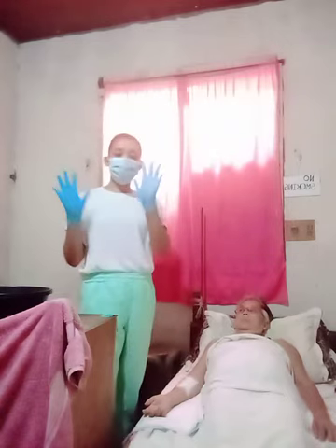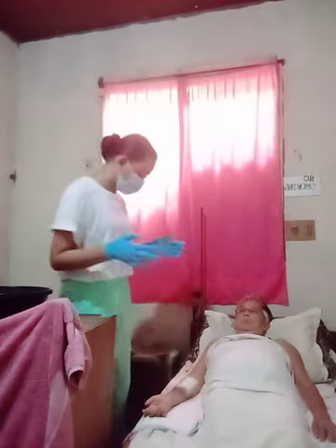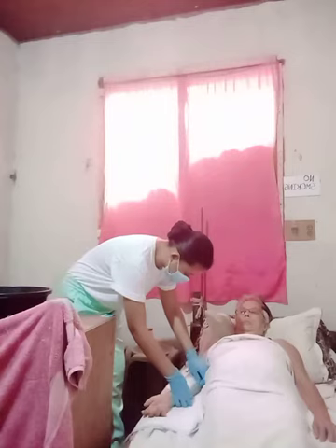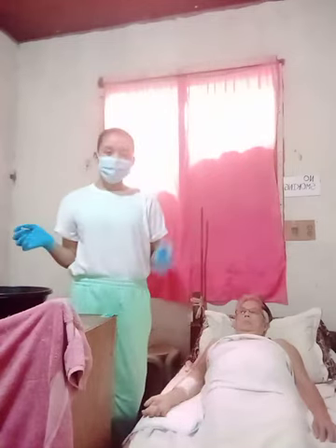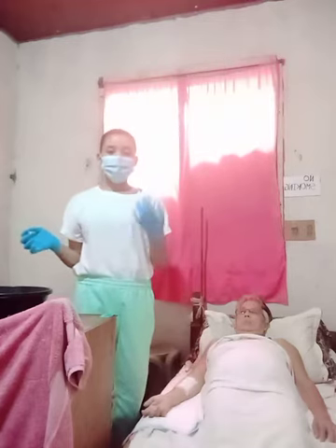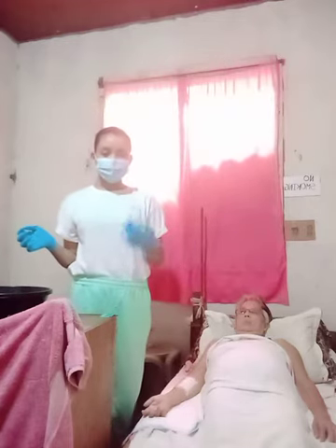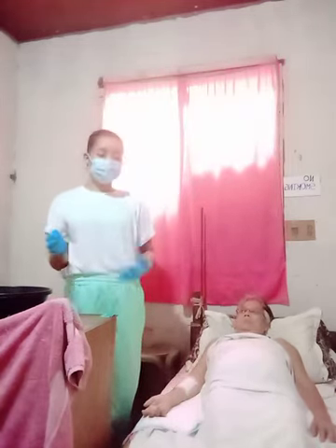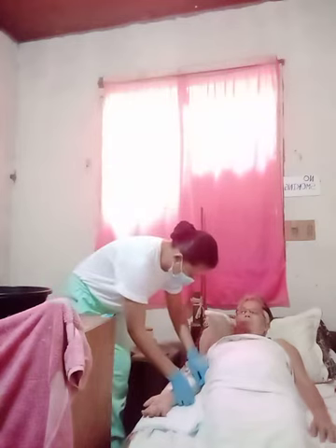With the gloved hand, carefully remove the gauze dressing one layer at a time, taking care not to dislodge drains or tubes, and keep the soiled undersurface away from the client's side.